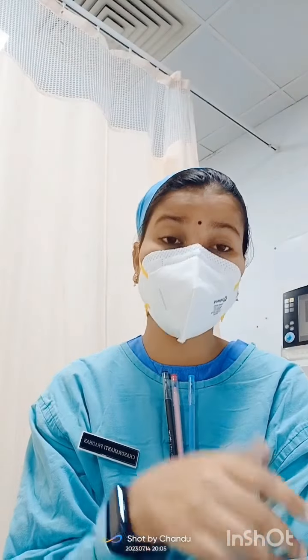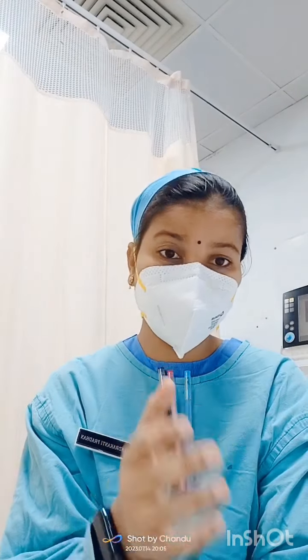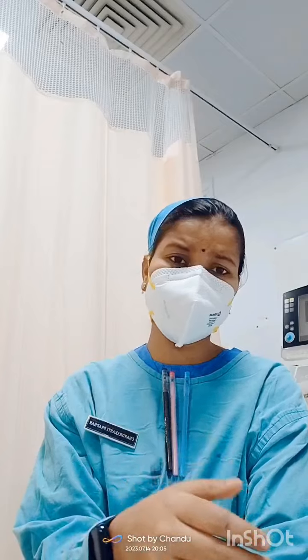Then energy selection: according to the condition you have to select the energy. And then the most important thing is, in cardioversion you have to choose the synchronized button, because the energy or shock is delivered at the peak of the R wave. In defibrillation we normally give the shock to the patient, but in cardioversion we always have to choose the synchronized button, because the shock is delivered at the peak of the R wave only.